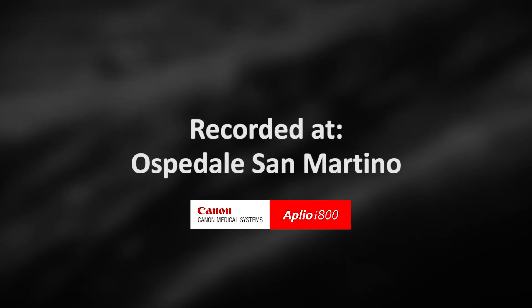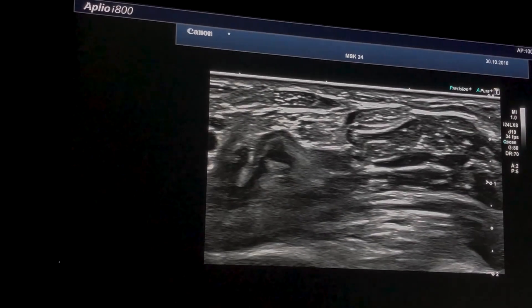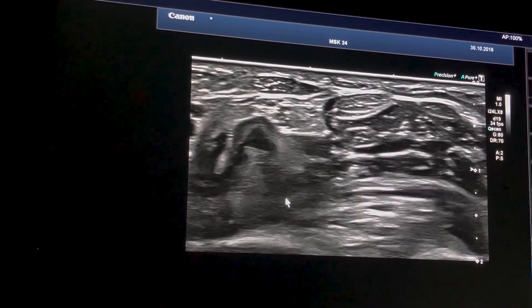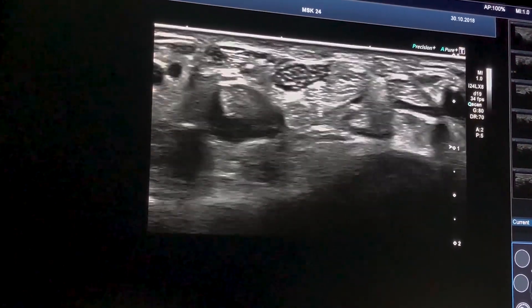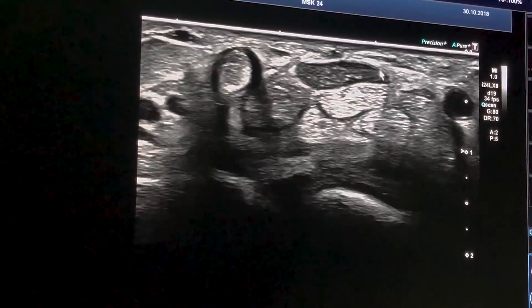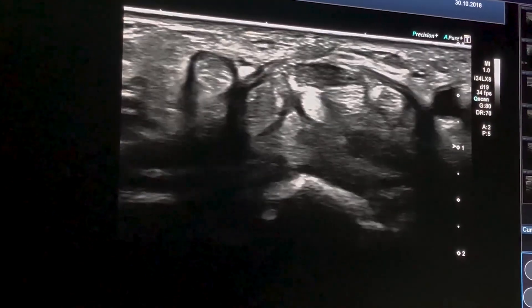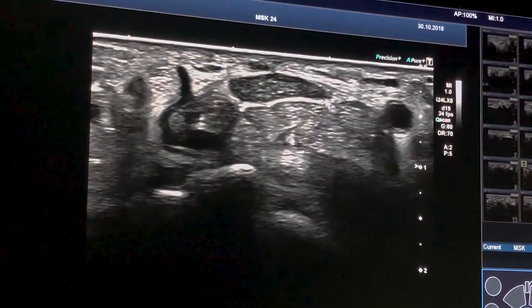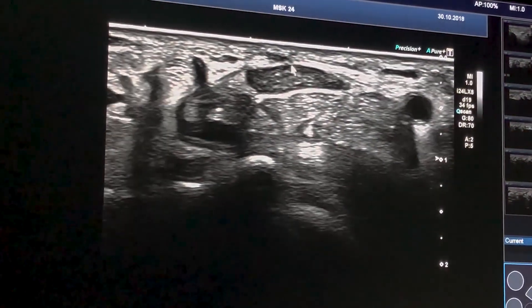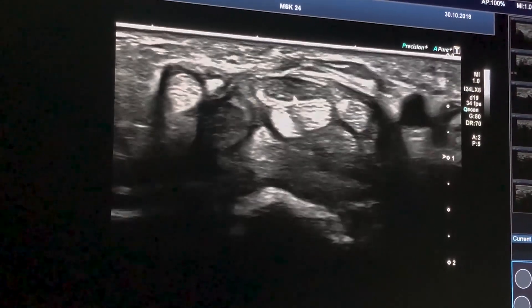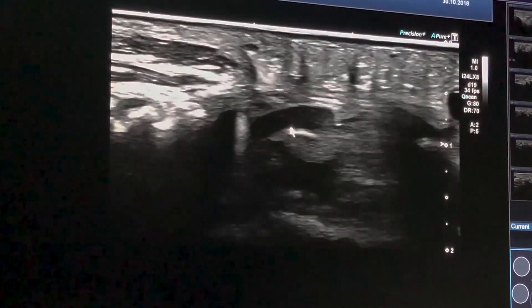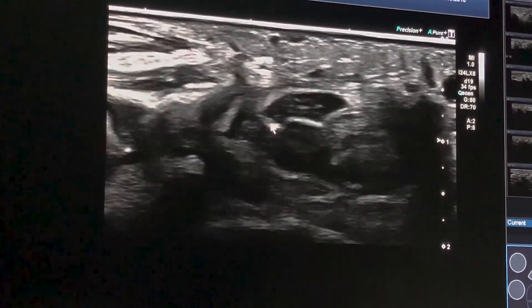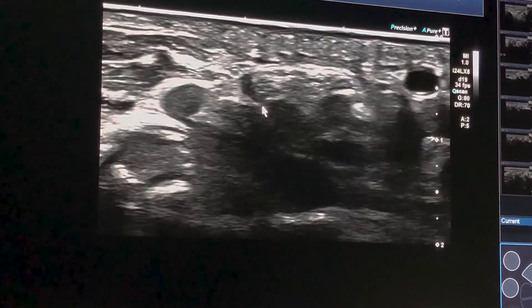This is a transverse view at the distal third of the forearm in a patient who had a previous carpal tunnel release. We can see the median nerve going towards the tunnel. There is a persistent swelling of the median nerve — in this case the patient had a very long-standing compression, and after release the nerve remained swollen, probably as a result of fibrotization of the intramural structure.